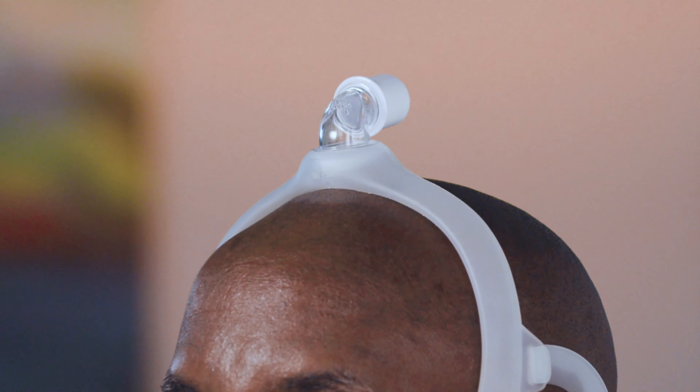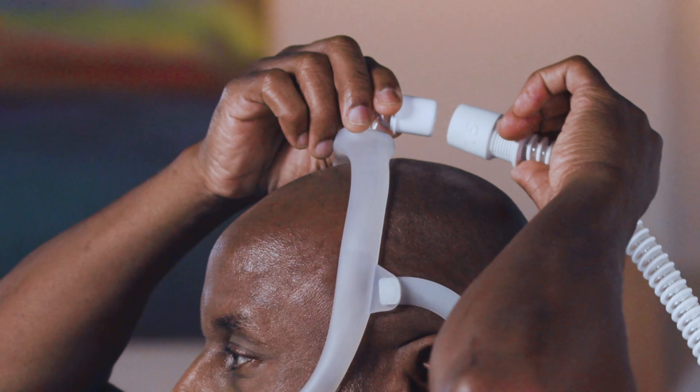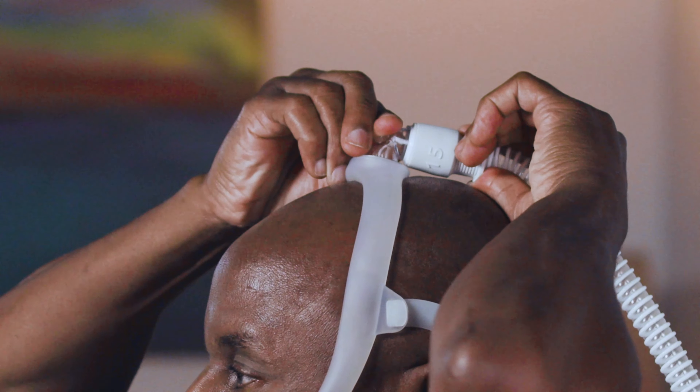When properly positioned, the elbow should sit at the top of your head and the mask should rest comfortably below your nose. Now connect the tubing to the quick release on the elbow.